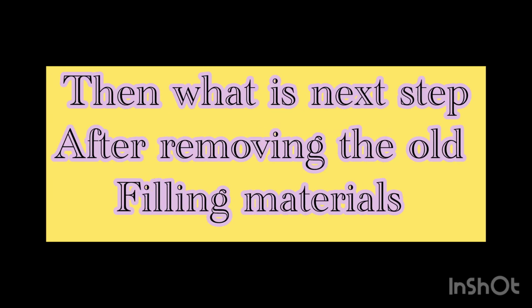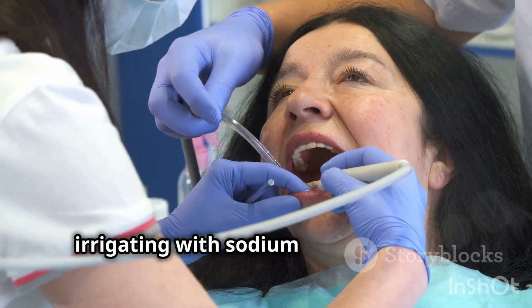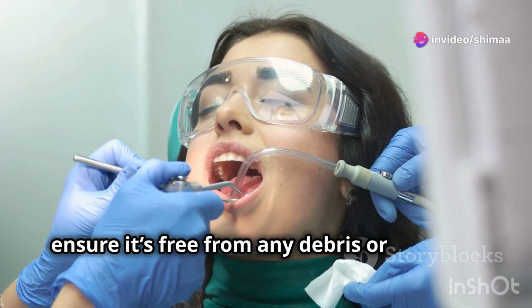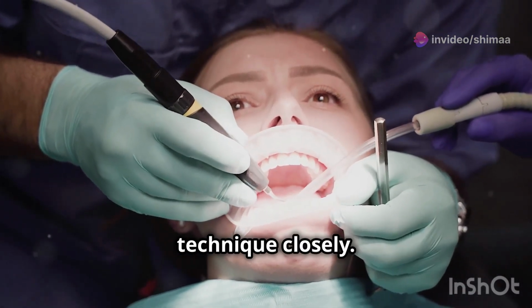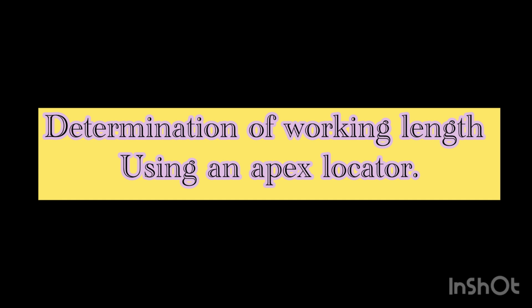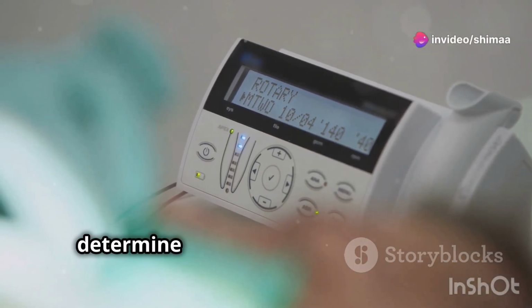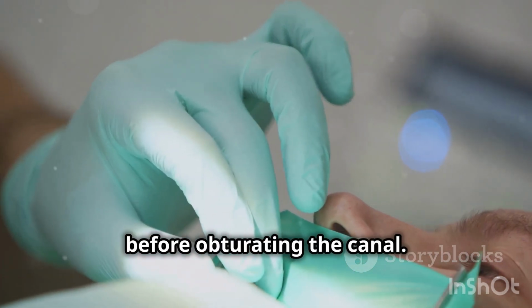Good. Once the old material is removed, how do we proceed? We will clean and shape the canal, irrigating with sodium hypochlorite to ensure it's free from any debris or bacteria. Make sure to follow the irrigation technique closely. We will then use an apex locator to determine the correct working length before obturating the canal.